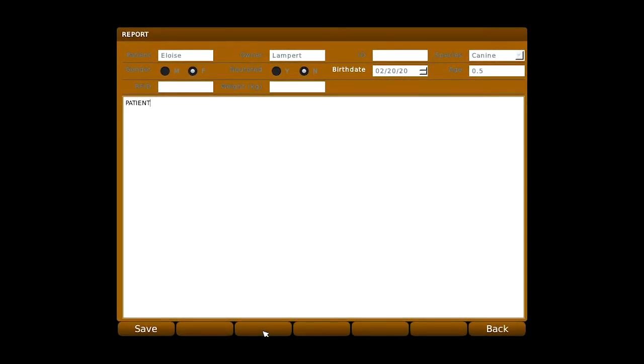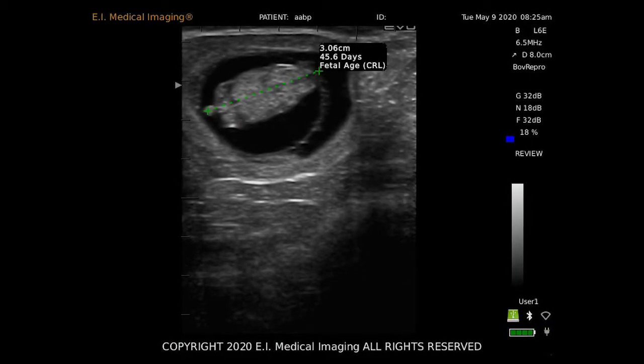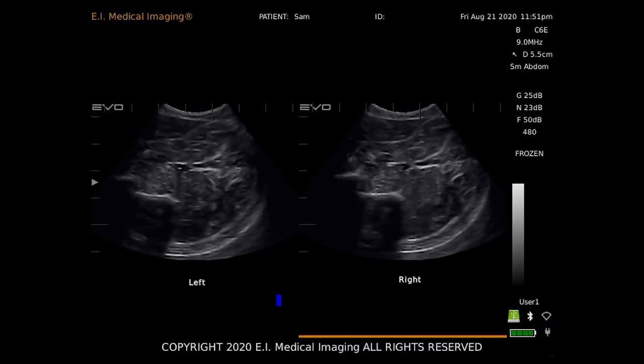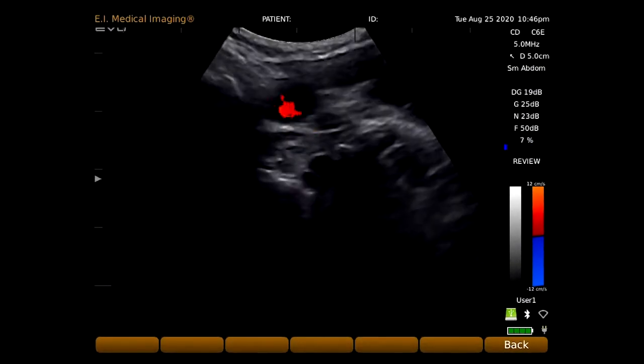The Evo software includes a variety of gestation tables as well as basic tendon and cardiac calculations. Use split-screen imaging to compare old images to new ones or to evaluate bilateral structures, and up your diagnostic capabilities with basic M-mode and Doppler functionality.